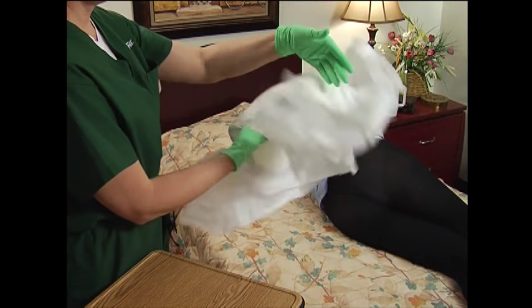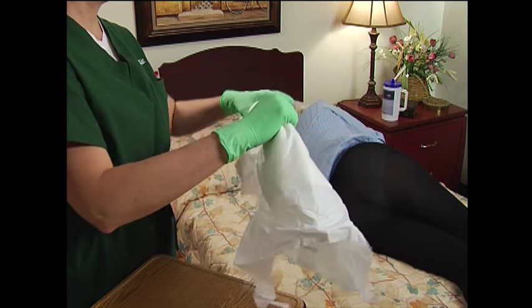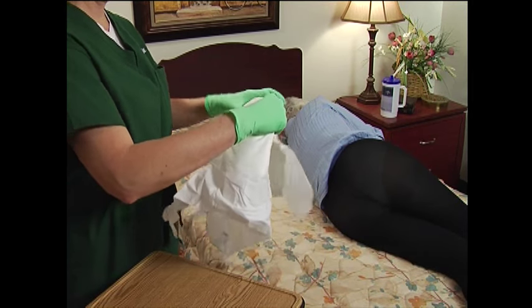Open the new brief and fold it in half lengthwise with the back sheet facing out. Give the ends a quick snap or tug to release the anti-leak guards.